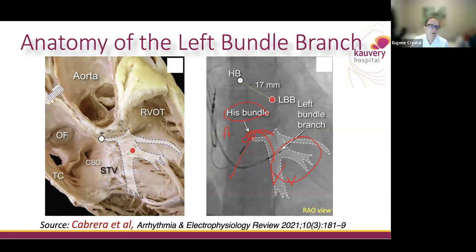Not really on that particular side, but as you transition to your cases, my question to you: how is this concept of pacing mapping changing the flow and the timing of your implantation, which is a very practical question, increasingly often.